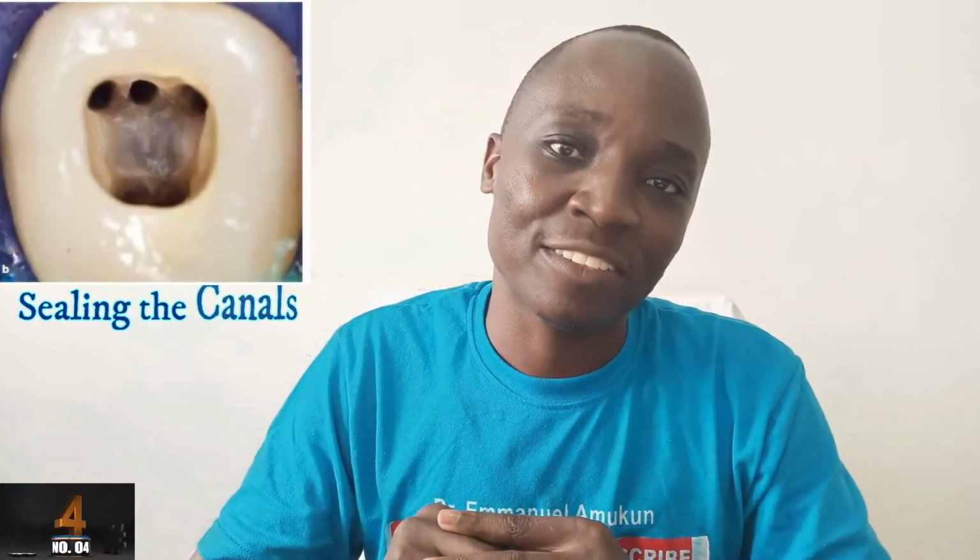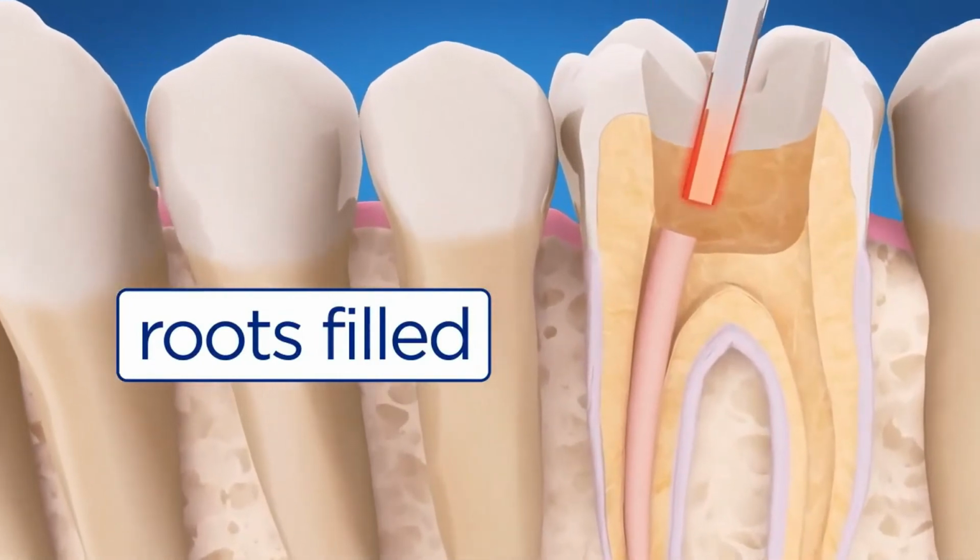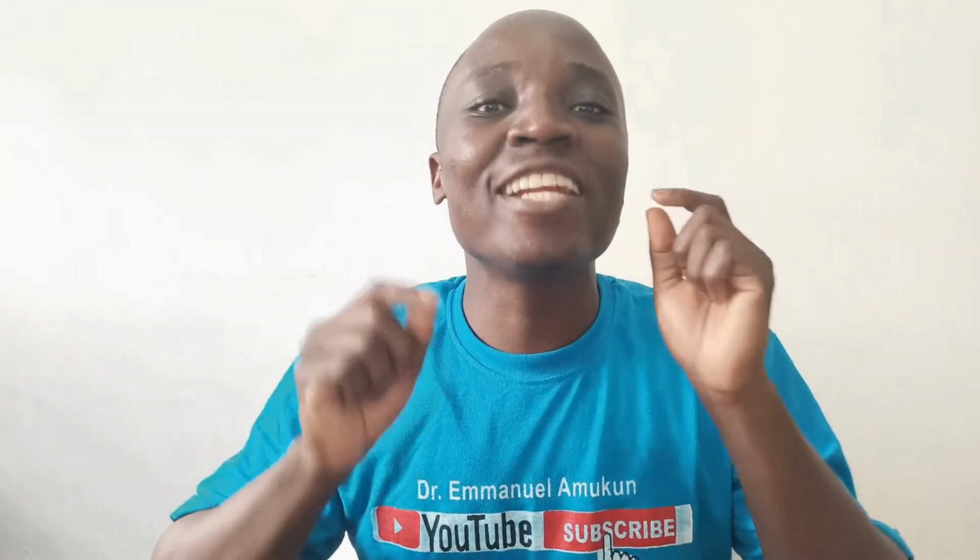Step number 4 is about sealing the canals. So in this step, we use another recommended material and then we push it right into the canals and then we seal it. And technically speaking, this is where the root canal treatment would have ended. But if we leave it like that, then it is not beneficial to the patient. So we move to step 5.